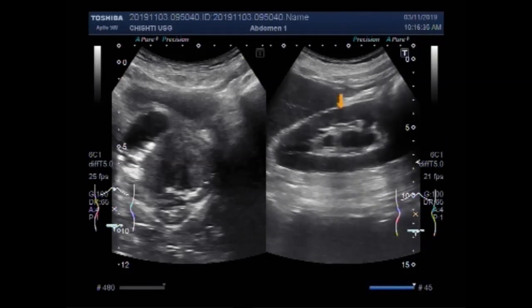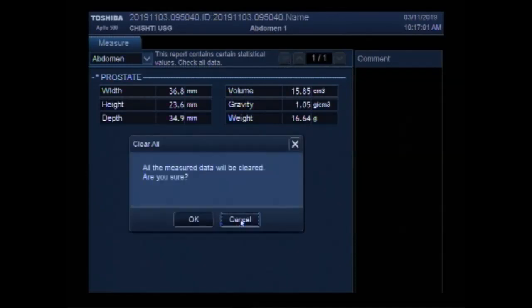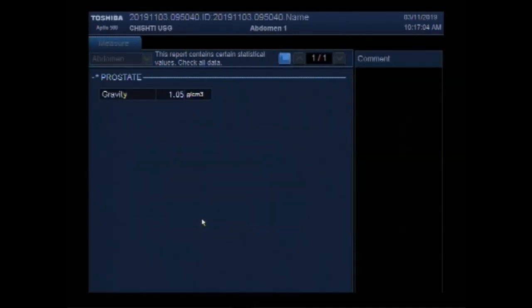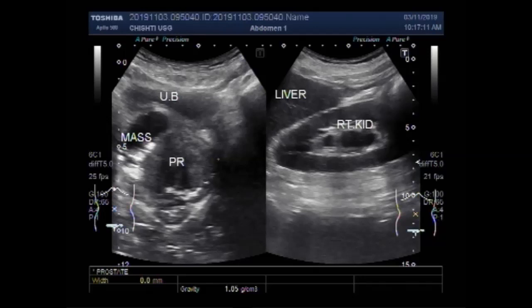Now you can see the liver, this is the right kidney, this is the prostate — enlarged prostate — and this is the cystic mass seen in the right lateral lobe of the prostate. You can see the measurement of the prostate. The weight of the prostate is 122.7 grams, which is quite a large prostate.